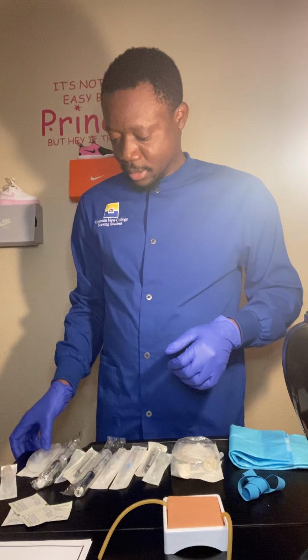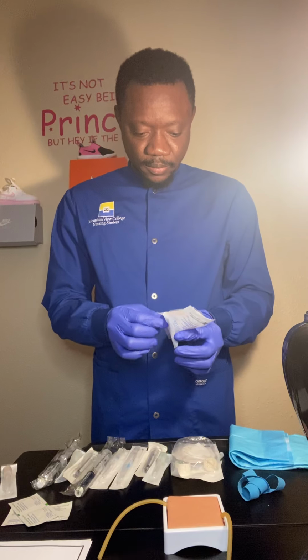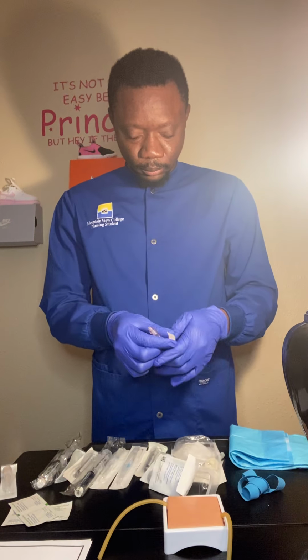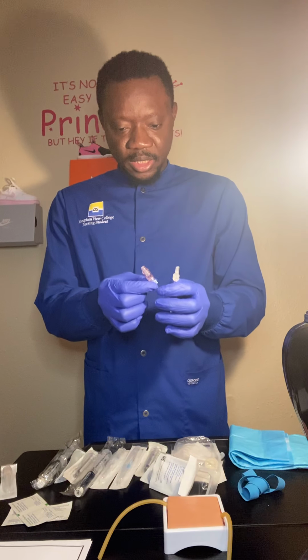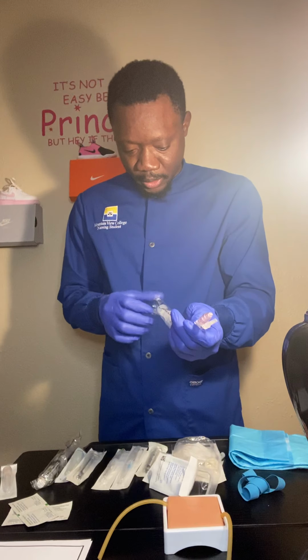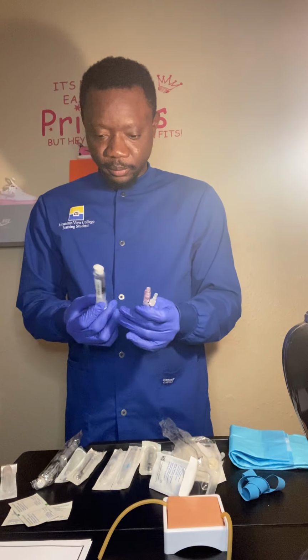And then I'll go ahead and the first thing I'll do is prime my IV extension. So this is my IV extension. And make sure to maintain sterility while I'm touching my IV extension. This is my normal saline.